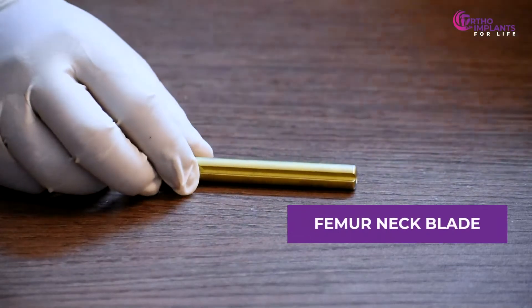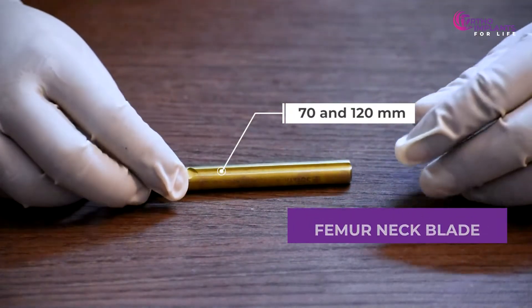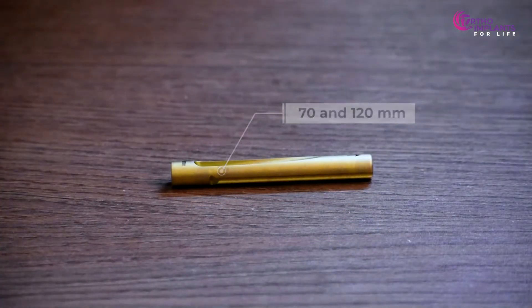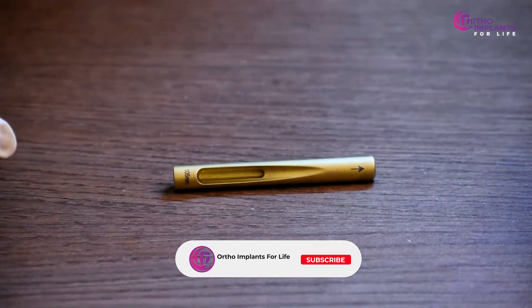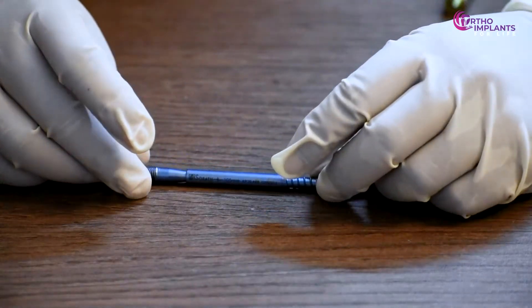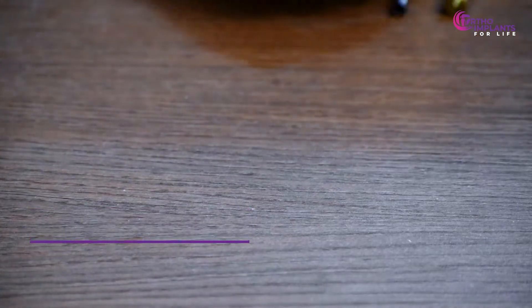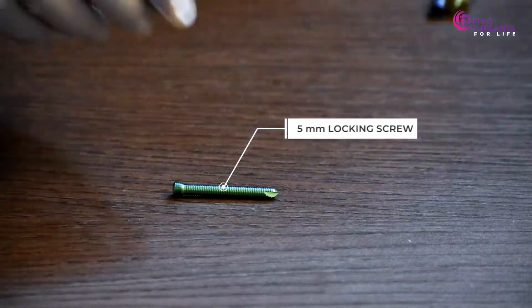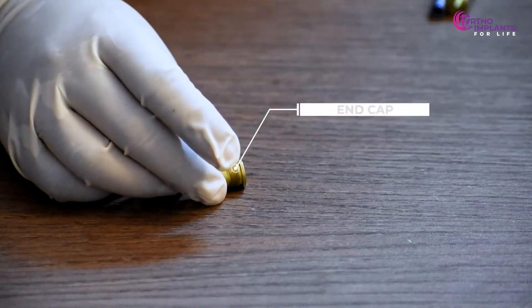Next we have the femur neck blade, which is available between 70 and 120 millimeters. Here's the femur neck screw. This is the 5 millimeters locking screw. And finally, this is the end cap.